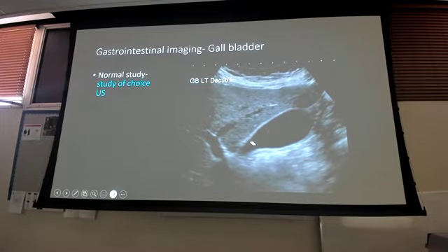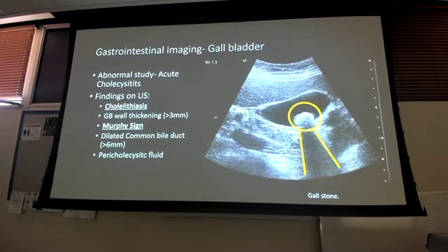There really is no tissue inside the gallbladder, so a CT is not super beneficial. I don't have a whole lot of blood flow to it except for just taking care of the gallbladder wall. There's really not a whole lot inside of it except for bile, fluid. So ultrasound is better because ultrasound will be able to tell me when there is a stone that is causing posterior acoustic shadowing, and I have that mass sitting in there from my ultrasound because I should be seeing fluid only, but I don't, right?